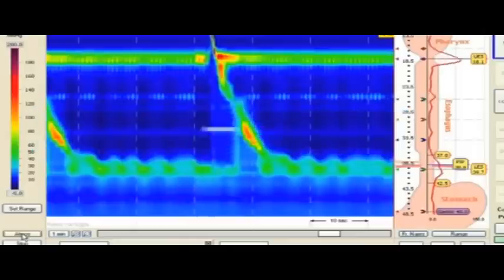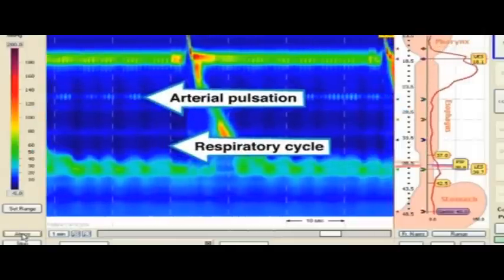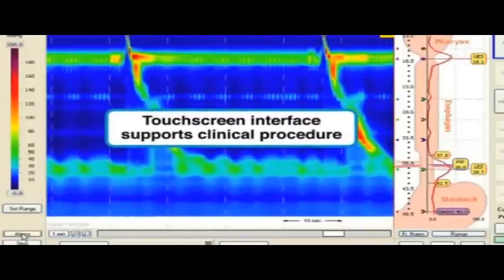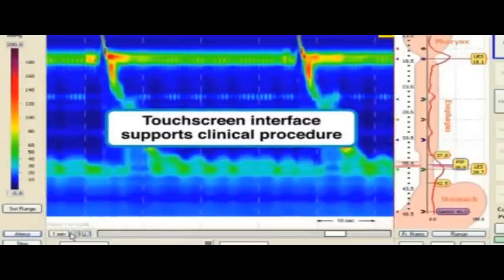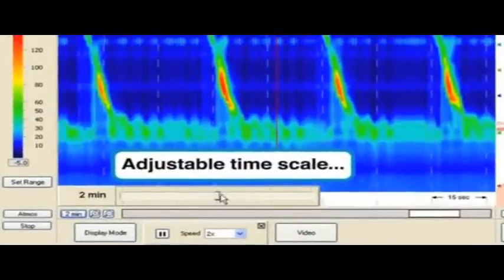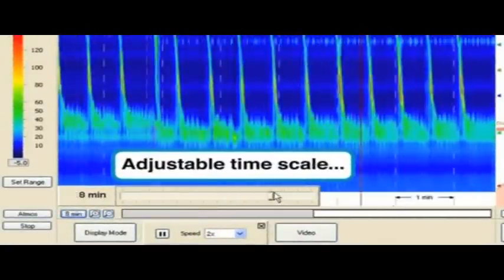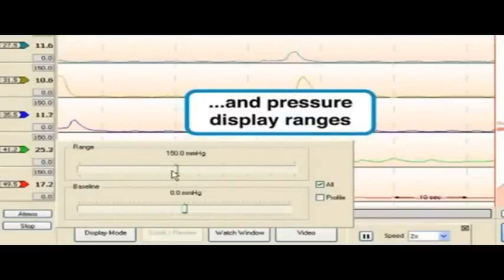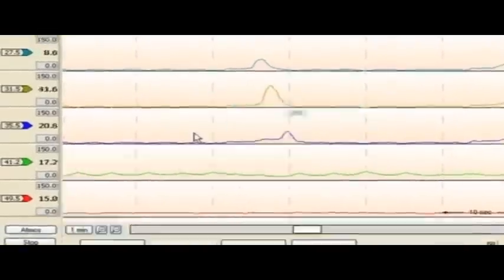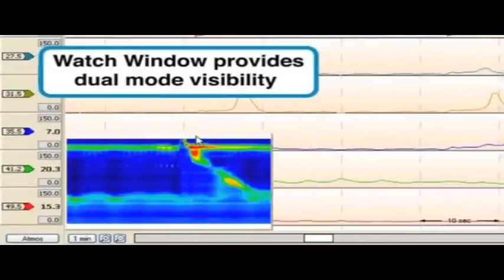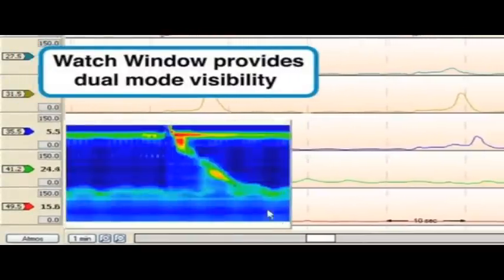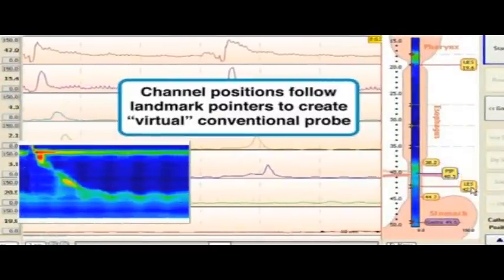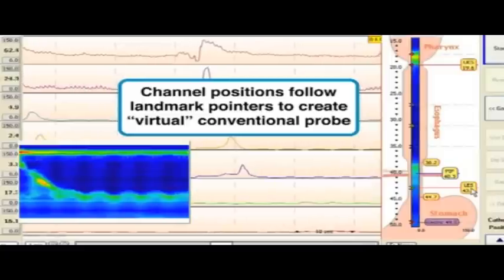Physiological signatures, such as arterial pulsation and respiratory cycles, are readily seen in the display. Touchscreen controls and simple recording functions save time during clinical data collection. Time scales are fully adjustable, and pressure ranges are easily changed, together or individually. A watch window function displays the high-resolution pressure images while in line trace mode, and channel positions are adjusted precisely relative to the true anatomical locations.